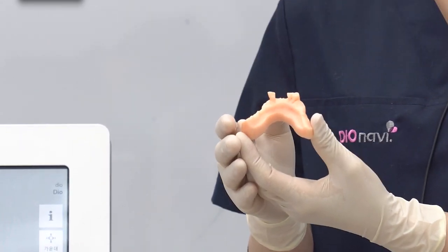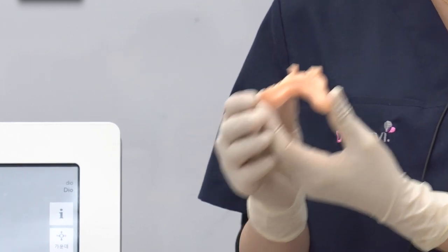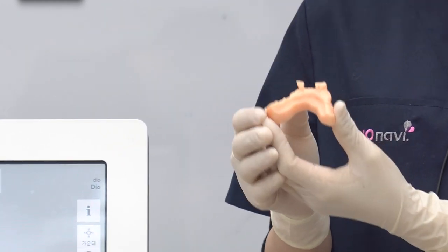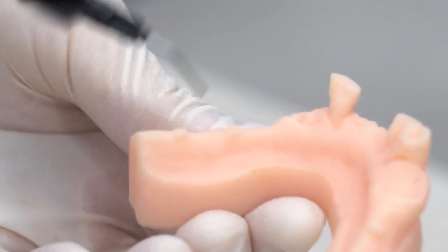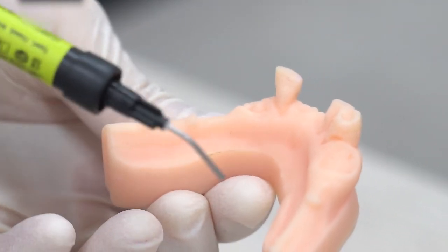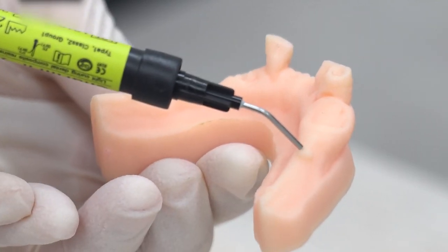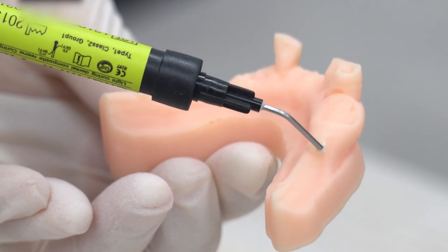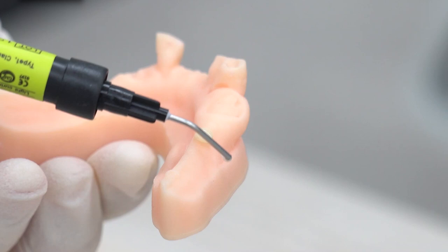If there is a metal crown in the mouth, you must put resin on the metal crown, because the metal crown will be distorted in the CT. I will now put resin. Resin should be placed around the alveolar ridge and it should be at least 2 mm in height.